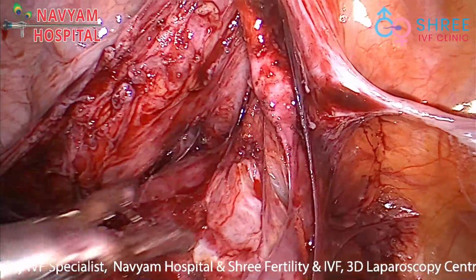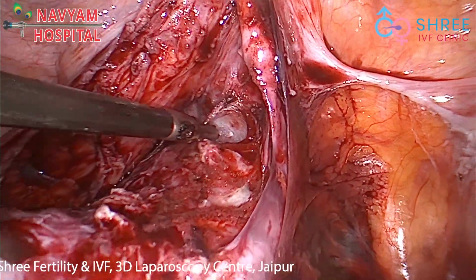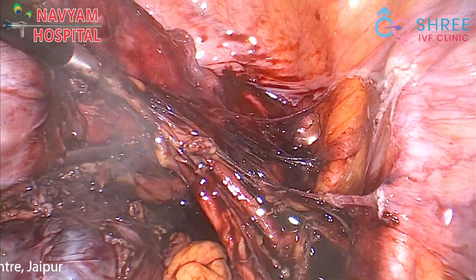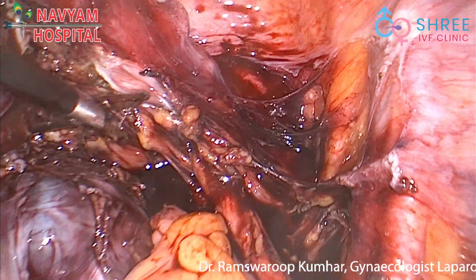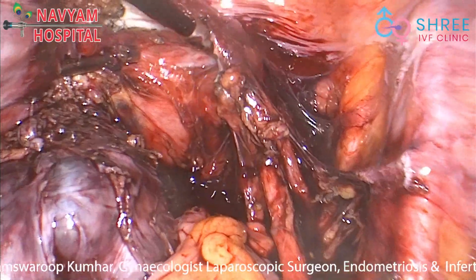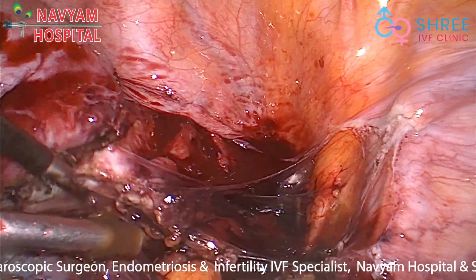The bladder is dissected very deep, then the few fibers which are remaining are cut open. For this dissection, we have to keep the ureter in vision, as the ureter is very far because traction was given to the opposite shoulder tip.